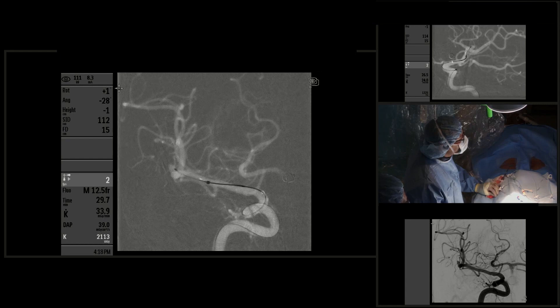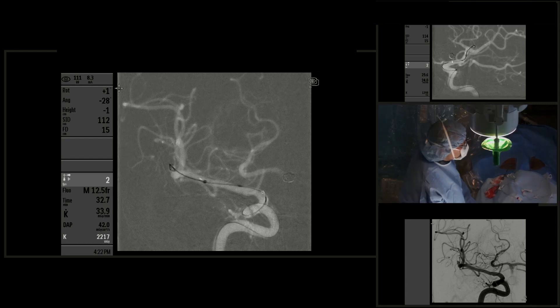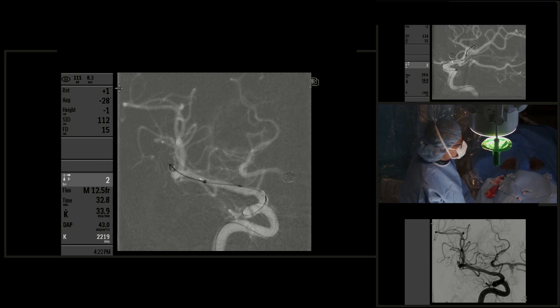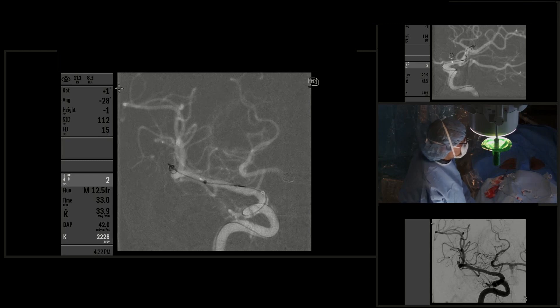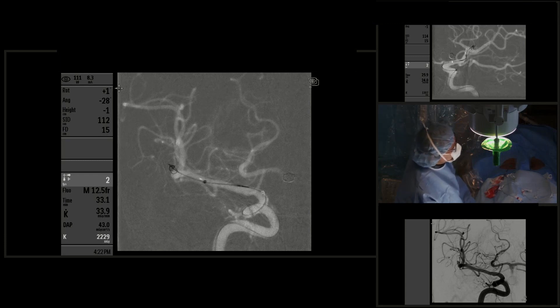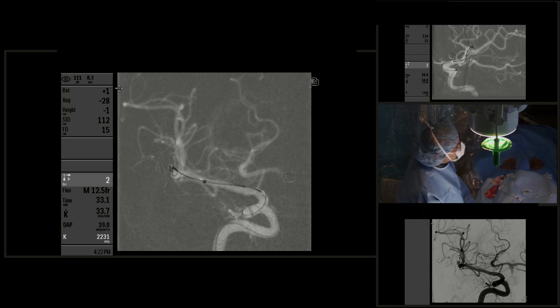Now the distal access catheter is in the distal M1 segment of the right middle cerebral artery. We're using the same Prowler 10 microcatheter that we used for coiling of the anterior communicating artery aneurysm for embolization of the right middle cerebral artery aneurysm. Again, we are advancing the coil into the aneurysm, and you can see a lot more stability of the microcatheter.